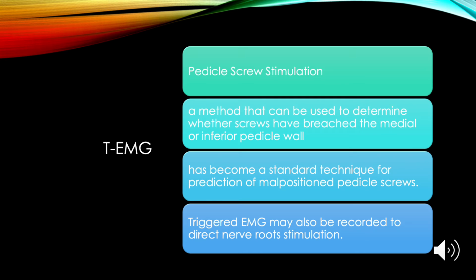Electrically triggered EMG, right, or TEMG, also known as stimulated EMG or evoked EMG, has ultimately become a standard technique for prediction of malpositioned pedicle screws.